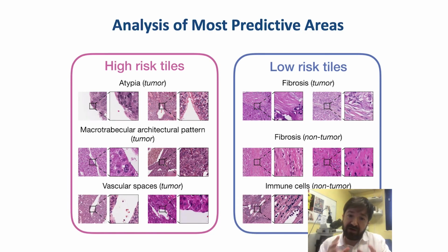What is also very interesting with these technologies is that they allow you to review the slides and indicate where the features most indicative of prognosis are. For example, you make a prediction of prognosis in a liver cancer. The model tells you this is a very aggressive cancer. Then you can go back to the slides and see what the cellular types were that were highly predictive of a poor prognosis. So you can generate new hypotheses.